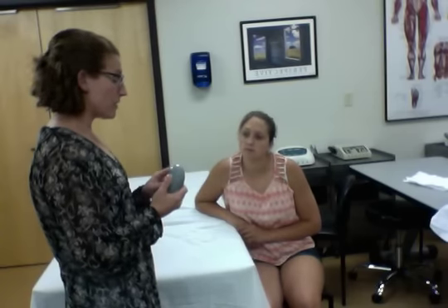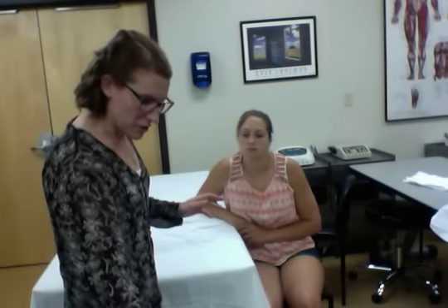Yep. So I think that one thing that might help it to heal a little bit faster is we'll do something called ultrasound. And what ultrasound is, it's waves of sound energy that come out of the ultrasound head here. And we can use it for warming up a tissue, but we don't really want to do that right now because it's still kind of inflamed and angry and we don't want to make it any hotter.